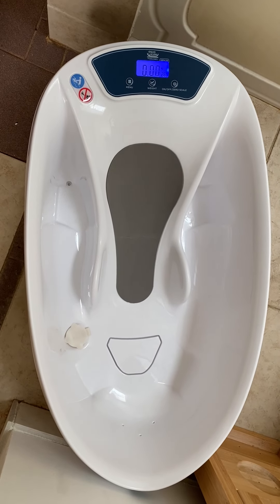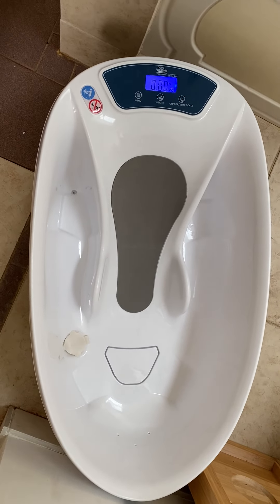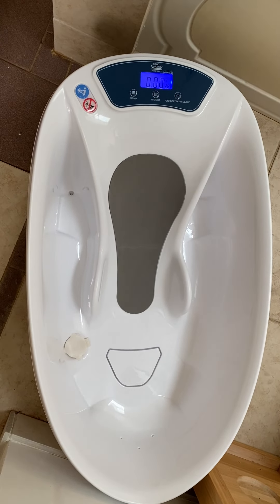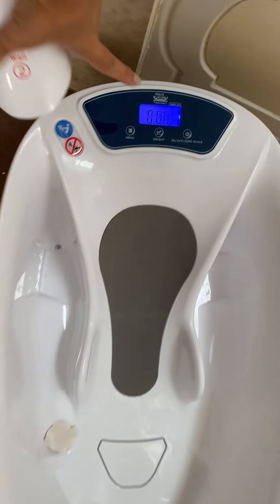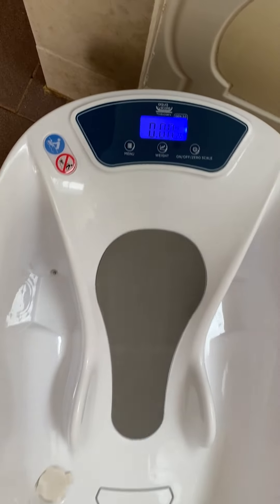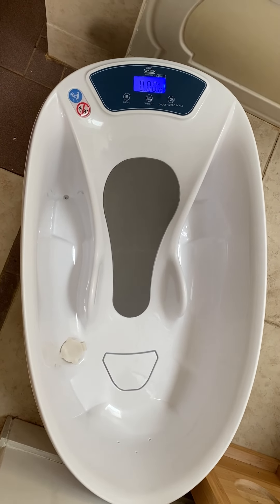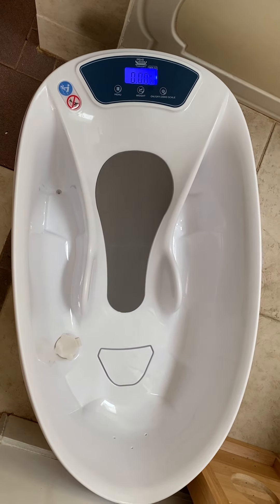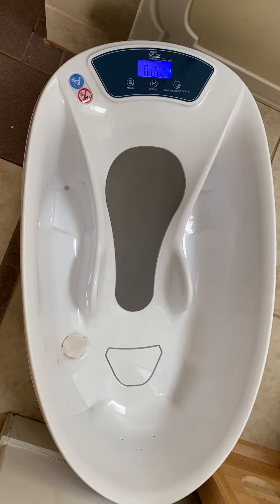If you want to weigh the baby without water, you just turn it on and place the baby here. Or you can use it as a bath — turn it on, put the water in, push the zero scale button to zero it out, then put the baby inside. He's relaxed and having fun with the water, but you're actually weighing the baby in an easy way, which is really amazing.